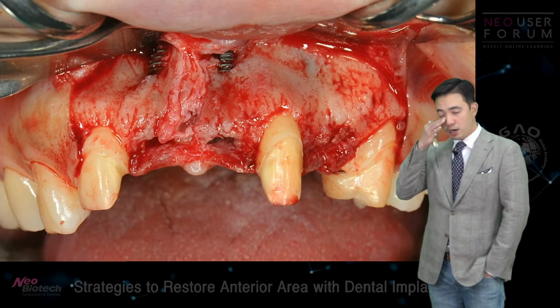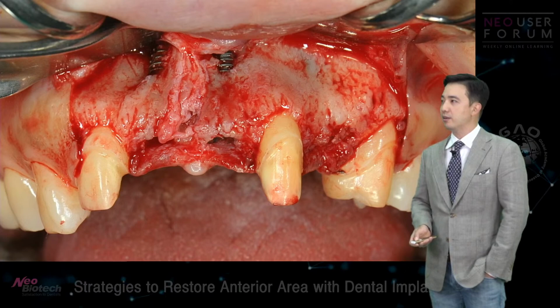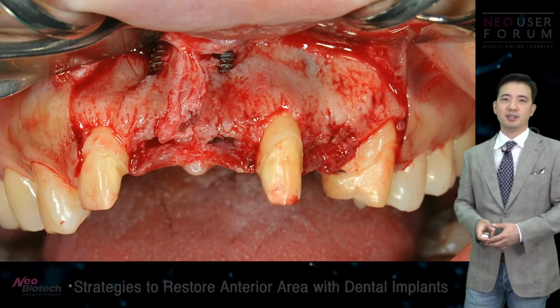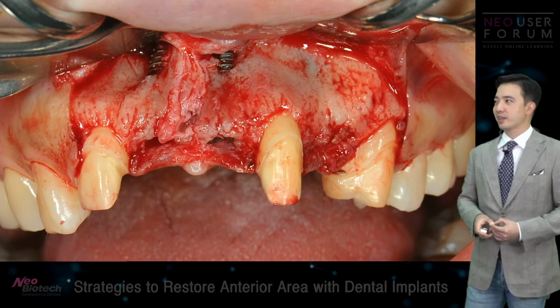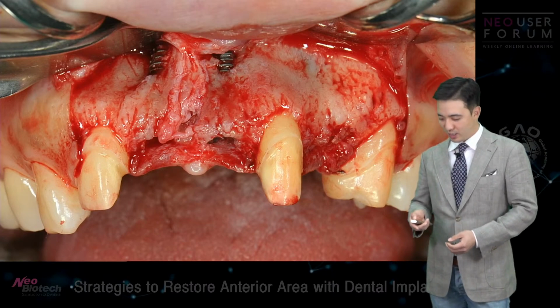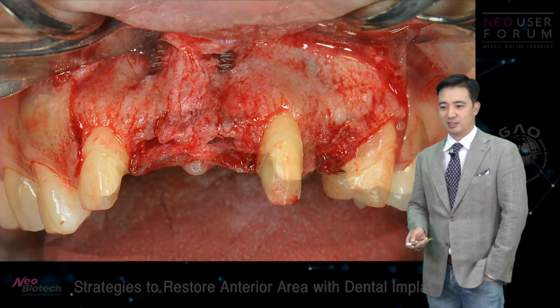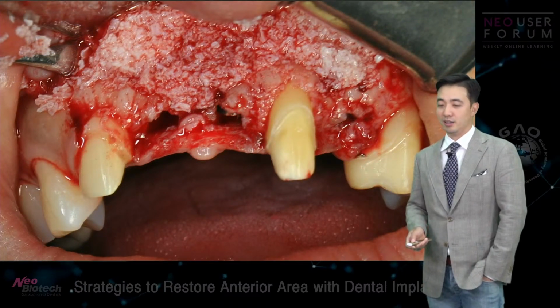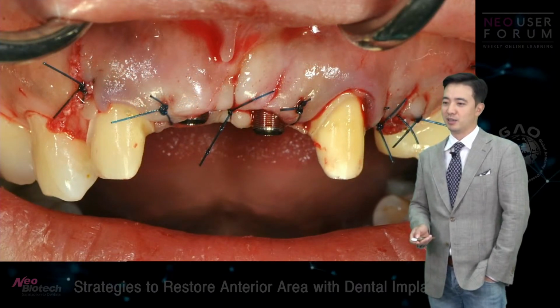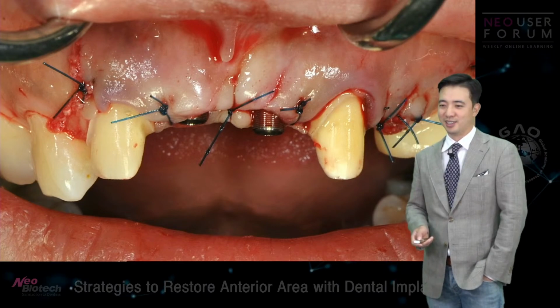The problem was, however, the amount of flap that I raised looked like this gigantic flap, right? I was so brave, I think, that I just went in. Okay, I'm just going to GBR the heck out of it, and then I added a lot of bone, sutured, and I thought, oh, I'm the best surgeon in the field.